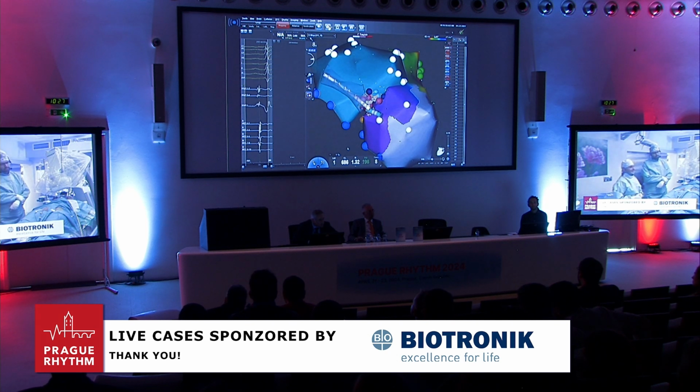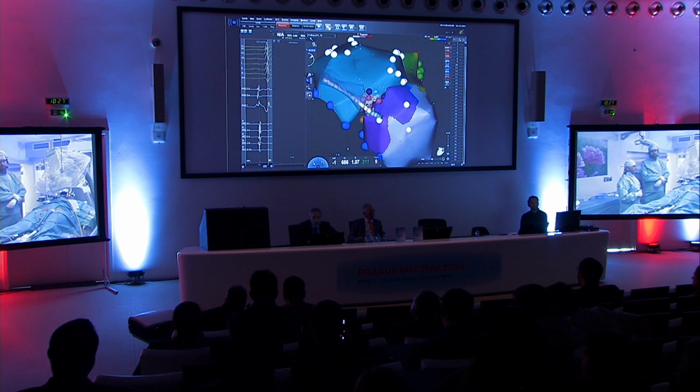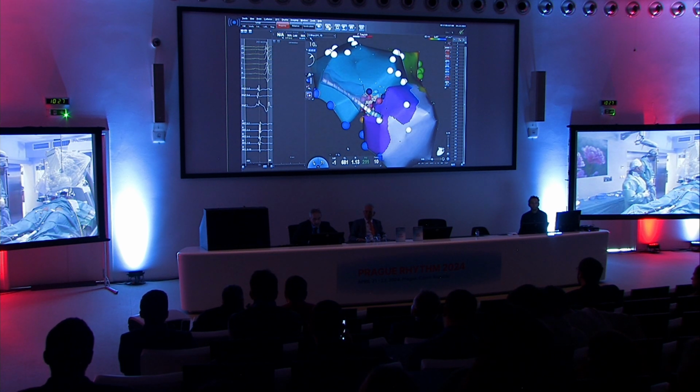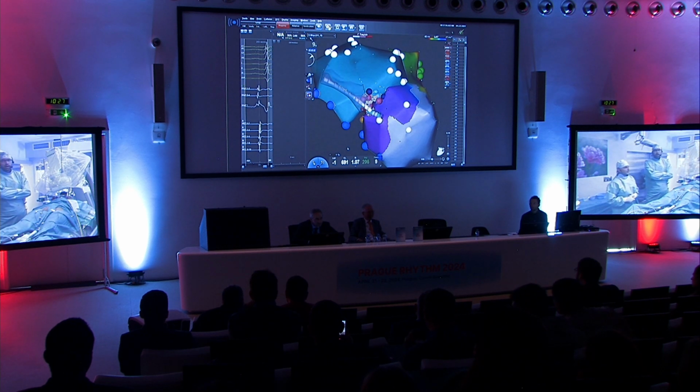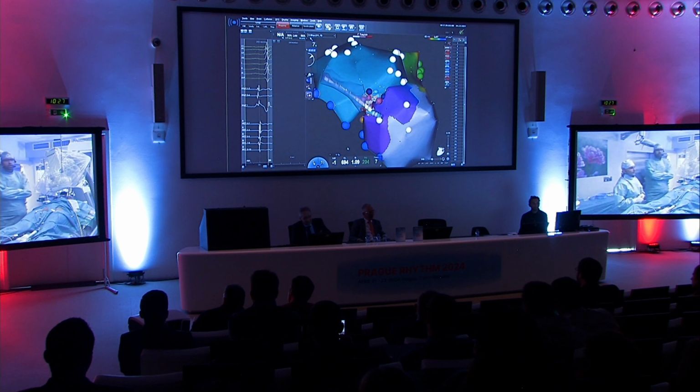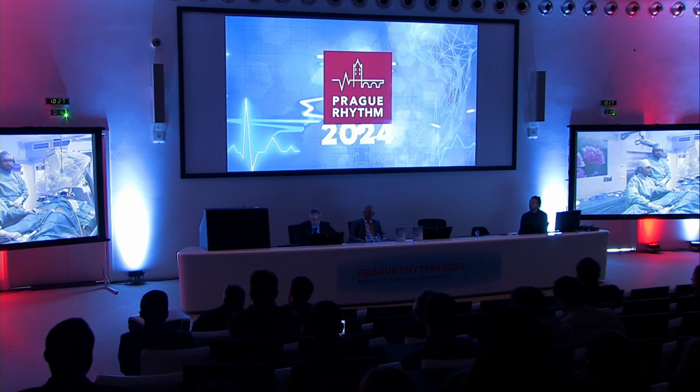But we use this Passion stimulator, which he gave us as a gift when he showed the first case here in 2015. I think room 3 is prepared. If you want to go there, we will finish a few more applications from the CS, and then we can come back. Okay, great.